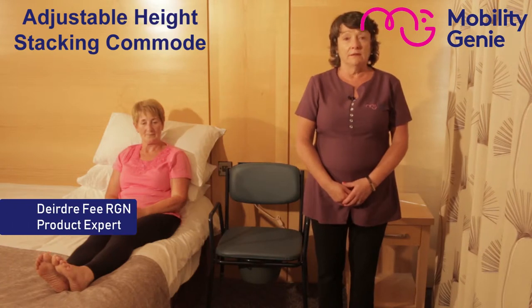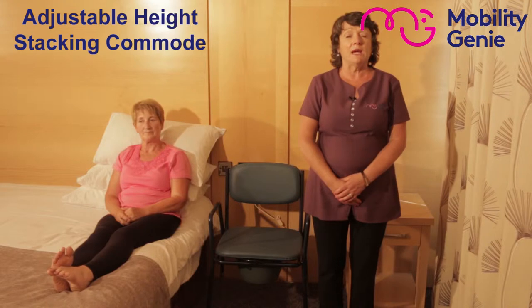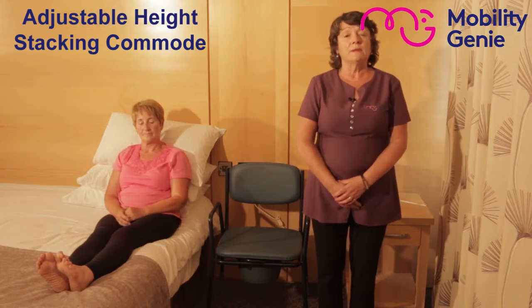Deirdre from Mobility Genie. At Mobility Genie we recommend the Performance Health adjustable height stacking commode. It offers comfort and stability. The reason that we stock the adjustable commode is that it needs to be set to the particular height of the user in order for them to easily get on and off the commode, as well as being able to remain independent while doing so.